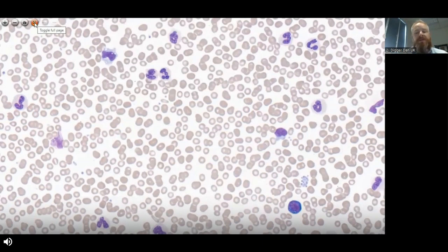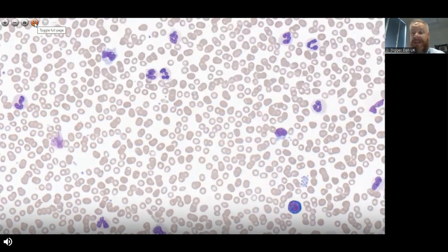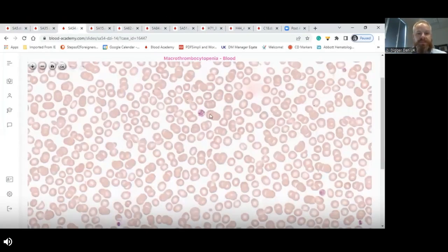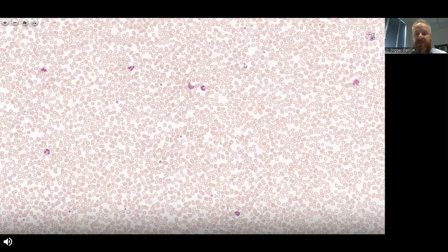Platelets can also be large, and if platelets are particularly large — even individually — they may not actually be included in the platelet count on your analyzer. They may be so large that they fall outside the threshold for inclusion within the platelet count. This really is what we're going to look at for the rest of this presentation: what's called the macrothrombocytopenias and the pitfalls.